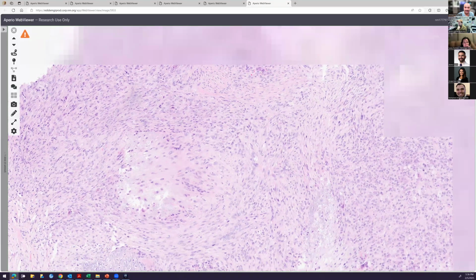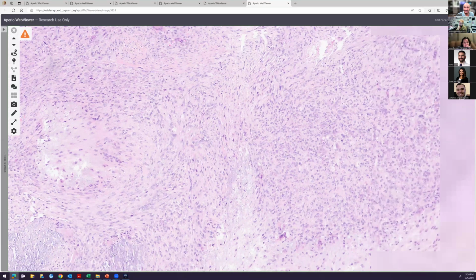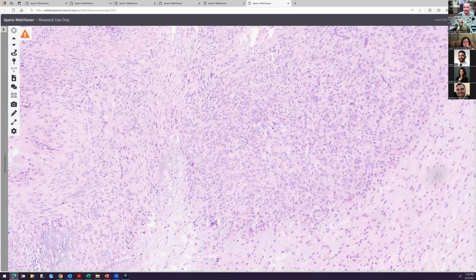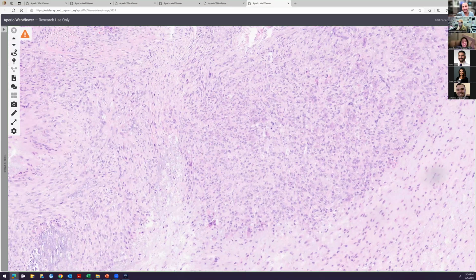So this is a weird tumor, right? It's not something we talk about a lot. I haven't really sat down with you guys at lecture all that often to talk about it. But this is what's called the calcifying aponeurotic fibroma.